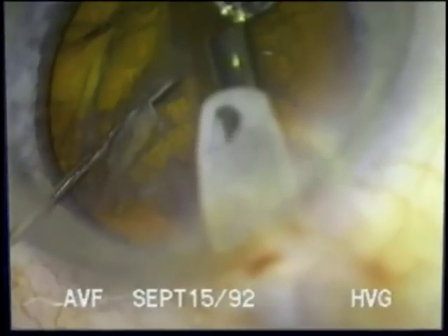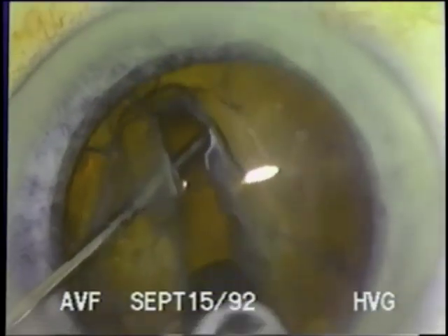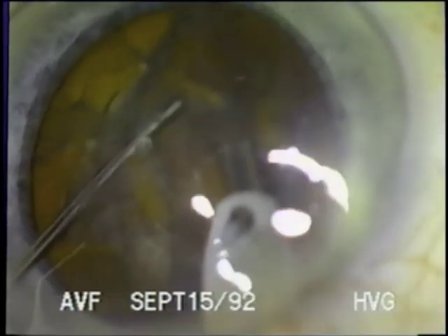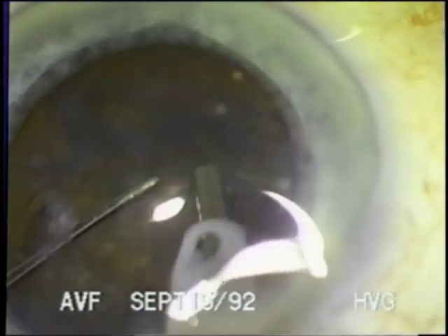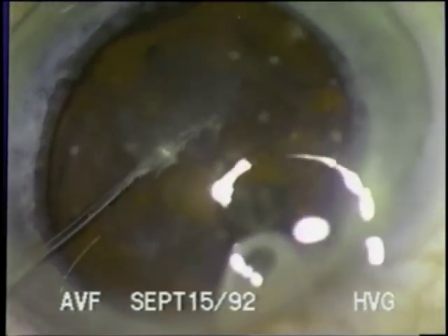In real time now, the nucleus is nudged inferiorly with the spatula as the phaco tip debulks the superior portion of the lens, sculpting parallel to the concave posterior capsule. The instrument tips are placed deep in the lens, and using direct action nucleofractus, a fracture is made. The lens is quickly rotated clockwise with a second instrument, and a second fracture is made near the first. Subsequent fracturing after the first initial fracture is accomplished without any pre-grooving, except in dense brunescent nuclei. This fracturing takes advantage of the radial fault lines inherent in the radial orientation of the lens fibers.